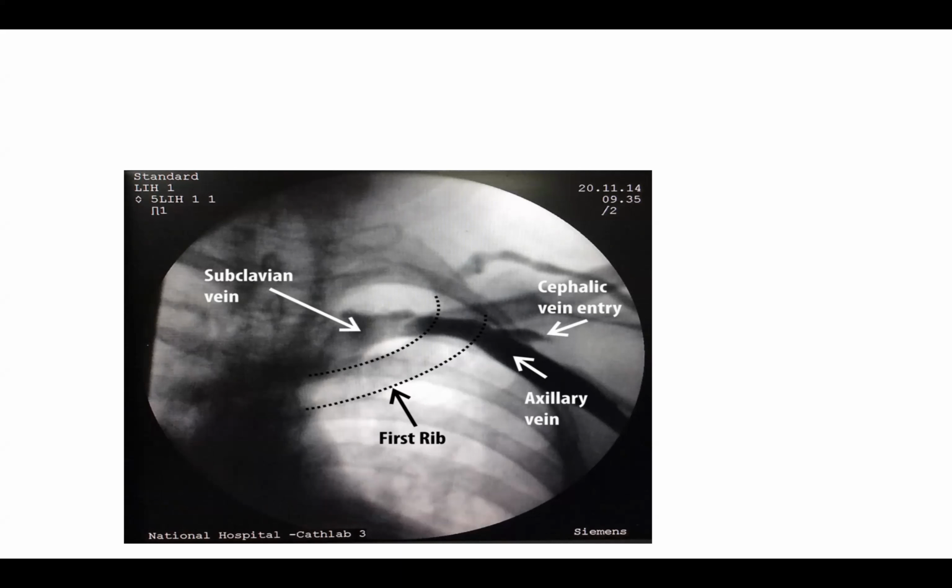You will get it. So if that exists, what you can do here is this. You can leave the wire there, then take an angiogram if you want to be sure of where you are, and you will see that you are in the coronary sinus, because if there is a persistent left superior vena cava, it drains directly into the coronary sinus.